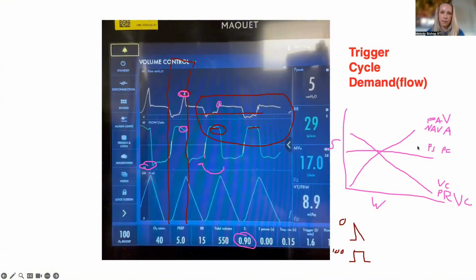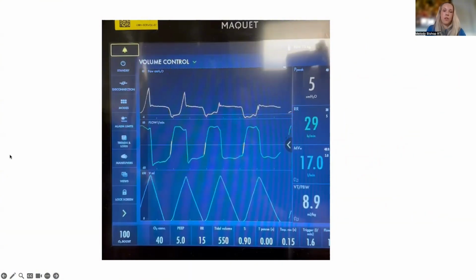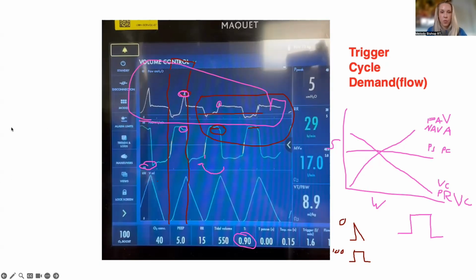If there's anybody that gives PRVC the hardest time, it's obviously me because it's the worst mode in the universe. But the problem is that it just looks like a regular pressure control, and most people who walk by think, oh, that looks normal, even though it could say 5 or something. But I think if most RTs walked by and saw just this part of it, they'd be like, wow, that looks horrible, what is happening there? Do you think that's fair, or am I off the rails here? I think all nurses would look at that and be like, let's page the RT stat, something's wrong.